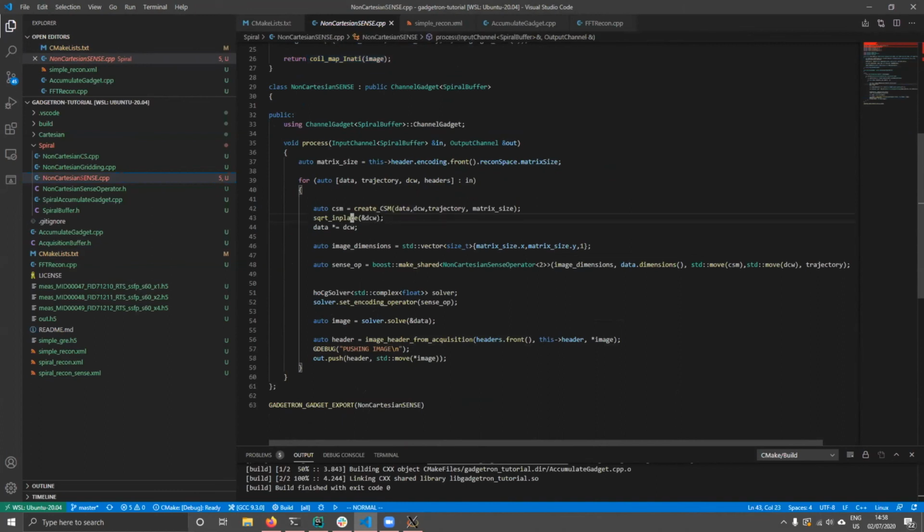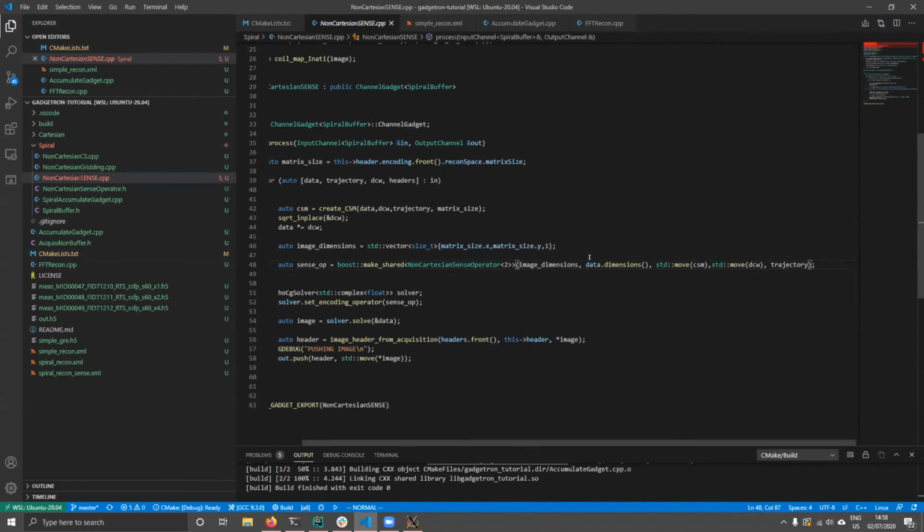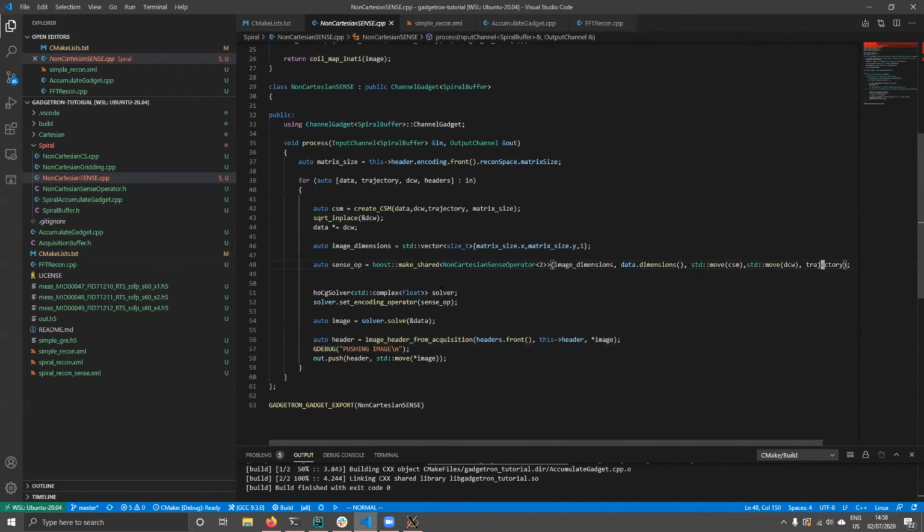Due to the linear equations in SENSE, we need to take the square root of the density compensation weights and apply those to the data. Then we make a non-Cartesian SENSE operator, which is also a part of the demo. You can see it's down here. It needs the image dimensions, the dimensions of the data, the coil sensitivity maps, the density compensation weights, and the trajectory.